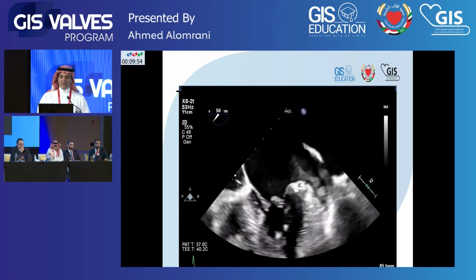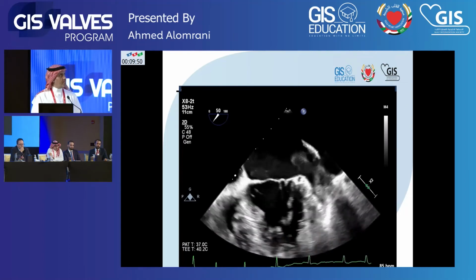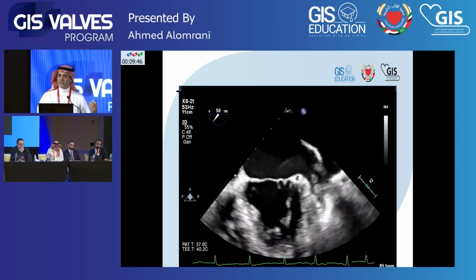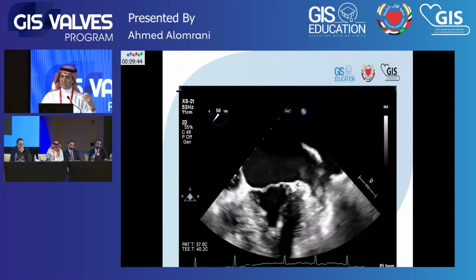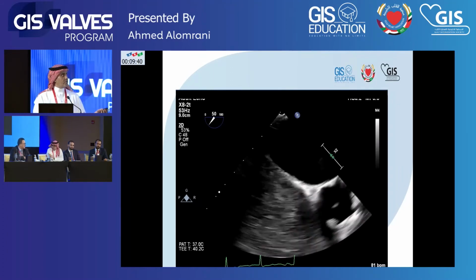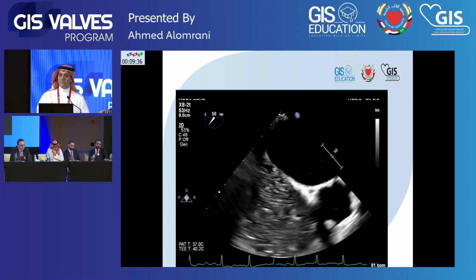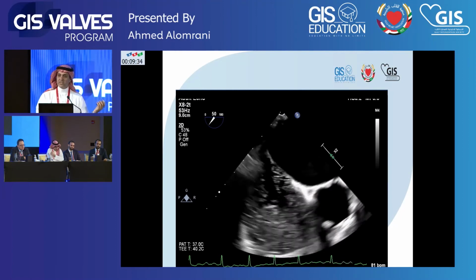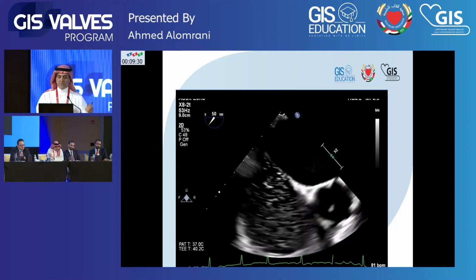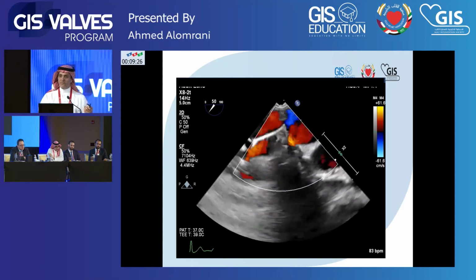We have to be very careful on this patient. A patient came to us for possible PFO closure, but you have a lot of left atrial appendage clots, so they need to be evaluated and assessed differently, not to go ahead and just push it. Sometimes you get a false impression that this patient has a PFO or a stroke, but when you get in detail in the cath lab and assess them under a more controlled, more directed catheter to the PFO, it will be negative, so you don't have to go further.